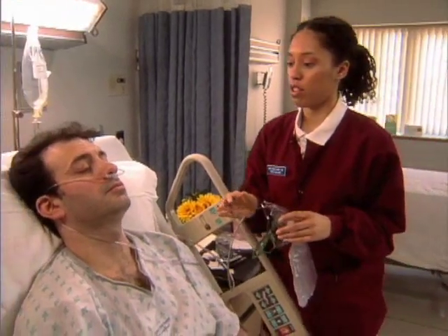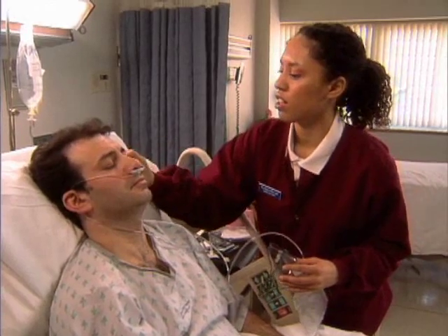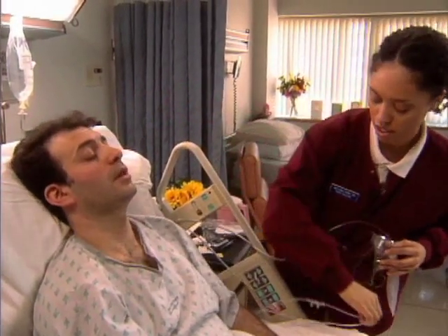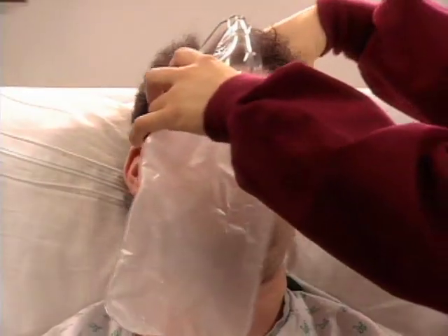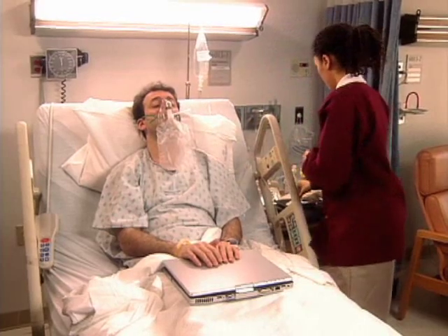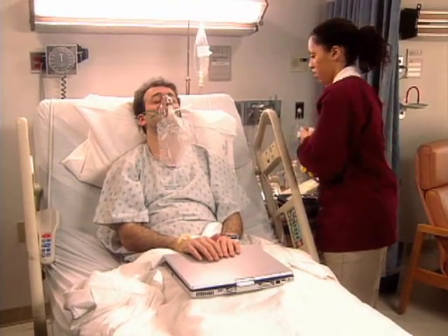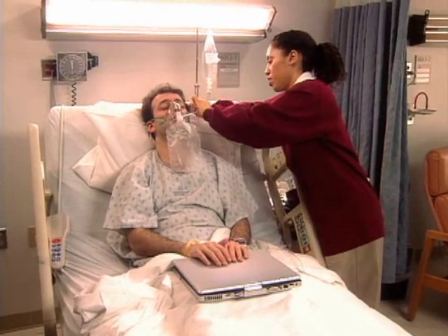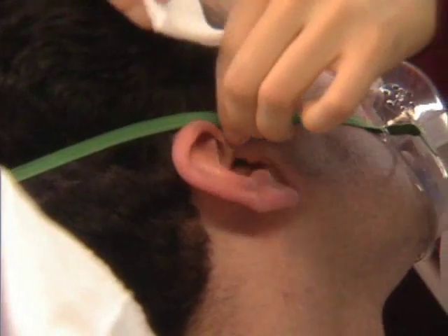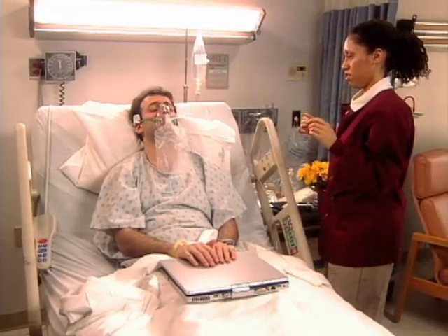Okay, I'm going to put the mask on you now, Mr. Simon, okay? Okay. We're just going to take these out. Right here. Put this on you. And it's here to protect your ears. Can you look at me? How's that feel? All right?